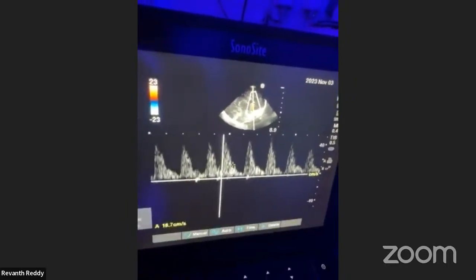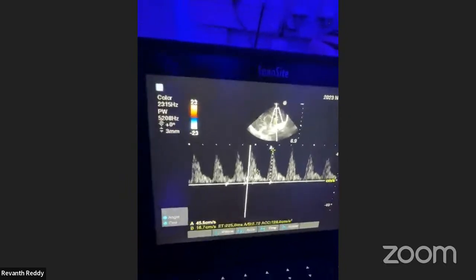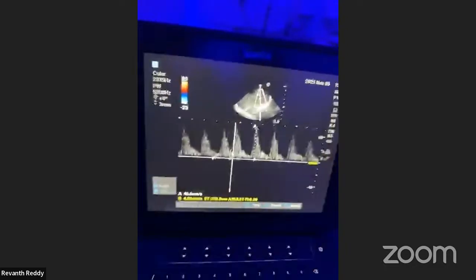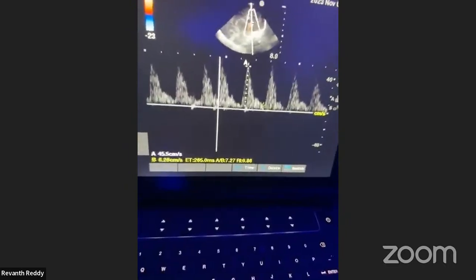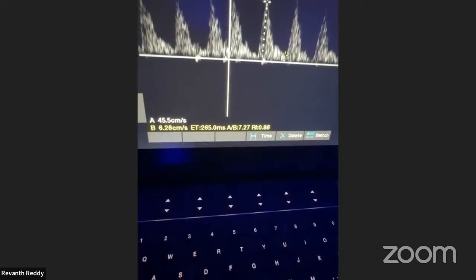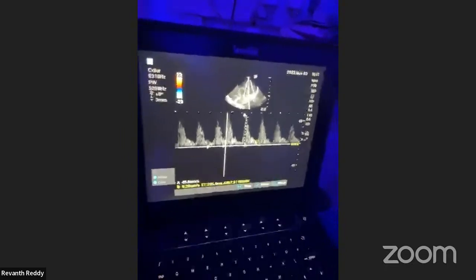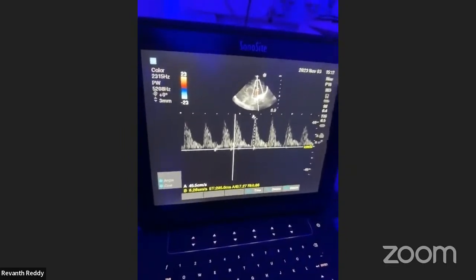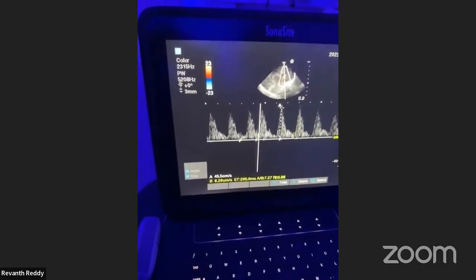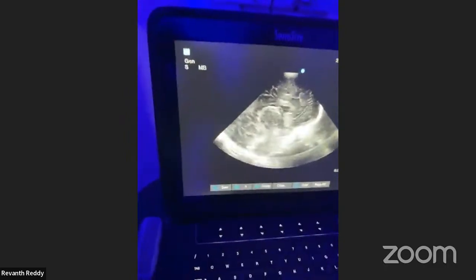So, peak systolic velocity we will calculate. This is the peak systolic velocity. Select, and then one more, end diastolic velocity we have to calculate. So this is the end diastolic velocity. According to the formula, if you calculate peak systolic minus end diastolic by systolic, it will become the resistive index. What are the conditions causing increased resistive index and what are the conditions causing decreased resistive index? Similarly for the pulsatility index, systole minus diastole by mean. So this is the Doppler over the ACA and the method to calculate the RI.